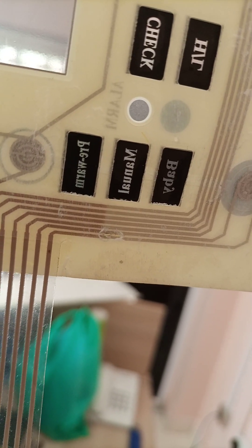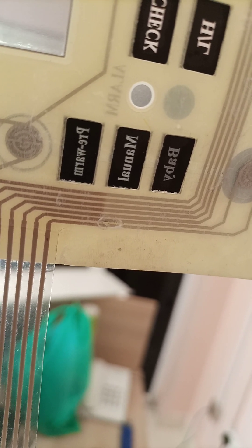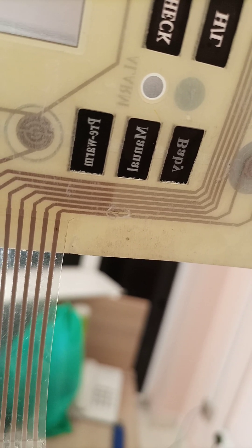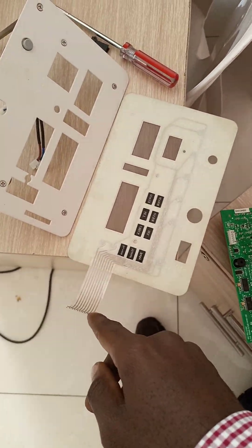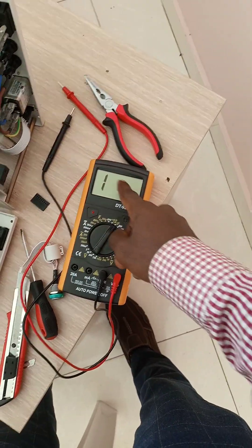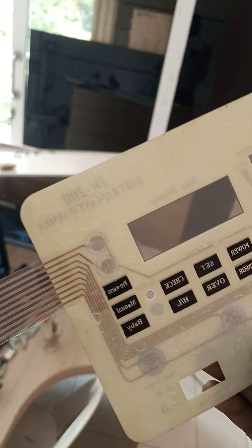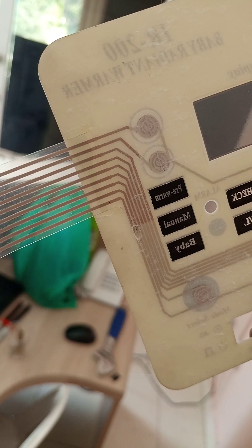I realized there was a scratch right there between the last two wires. When I measured the continuity between those last two wires, the alarm wasn't sounding but it was giving a value, meaning there was some partial connection between them. I used a very fine metal tool to remove the dust or debris that was causing that connection.